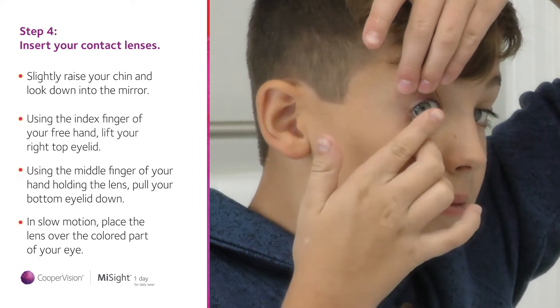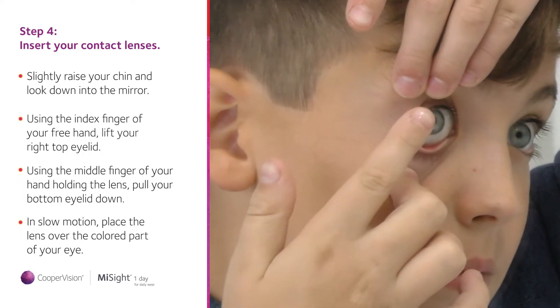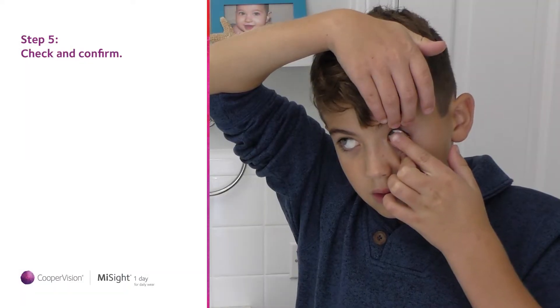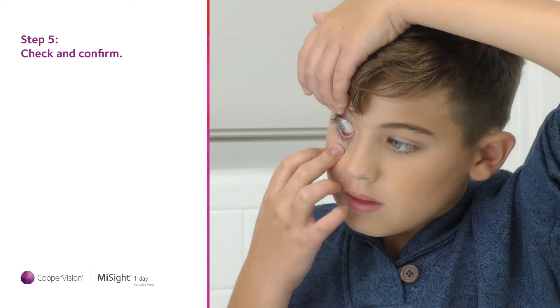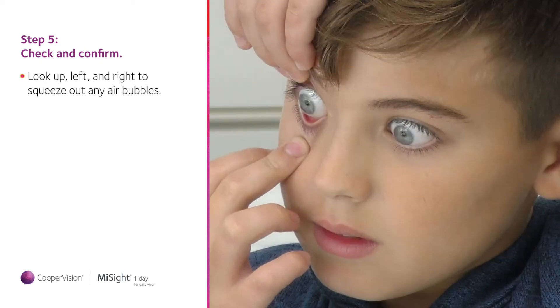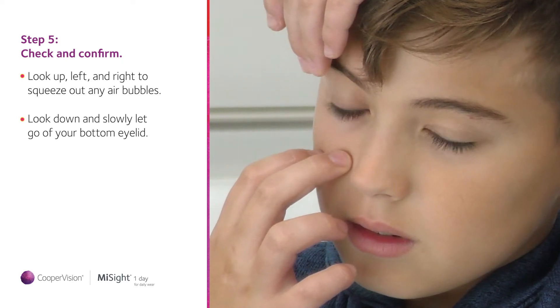Now concentrate on keeping your eyes open and look straight ahead into the mirror. Once you feel the lens on your eye, slowly move your index finger away from your eye but keep a hold of your eyelids. Slowly look up, left and right to squeeze out any air bubbles. Look down and slowly let go of your bottom eyelid.